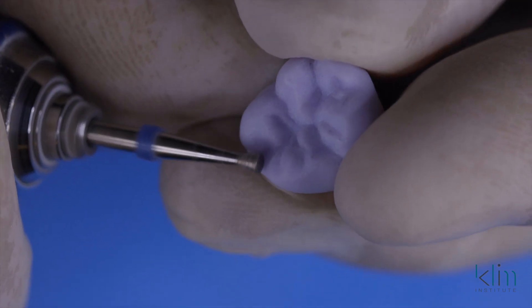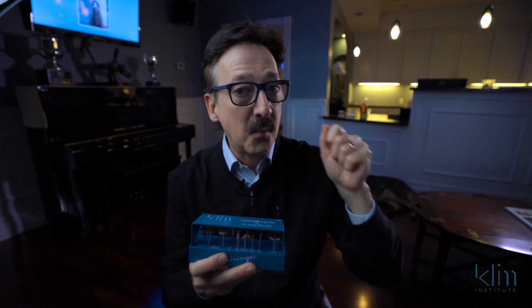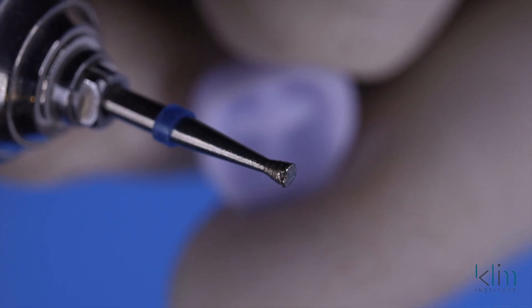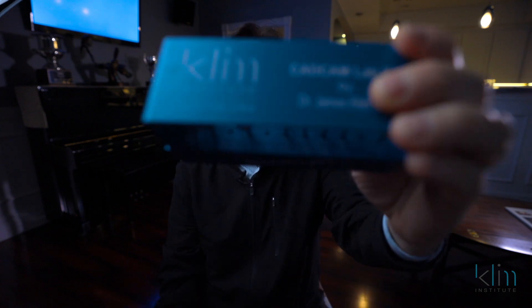Once it comes out of the milling unit, we're going to fit it in the mouth, make sure it fits the way we want it, and then take it to our lab bench or chairside bench and go through a very refined step of finishing. Before we start the shaping process, we want to have a really good handpiece. If you're working chairside, it's great to have an electric handpiece for the torque. I prefer to use a lab handpiece that has really good torque to it, and then you want really good, excellent instruments to work with.